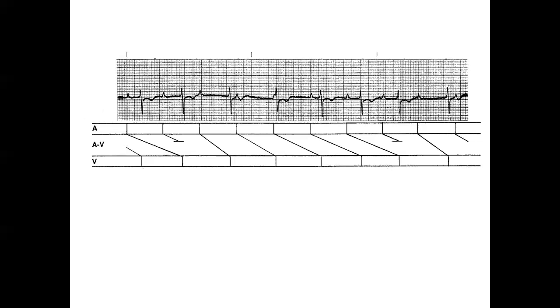There's no other way to draw this diagram. So sometimes a P can be conducted not to the next one, but one after that. Are you comfortable with this situation? What? This P not conducting to that one, but conducting to this one? And this is from that P? Yes, that's what it is.